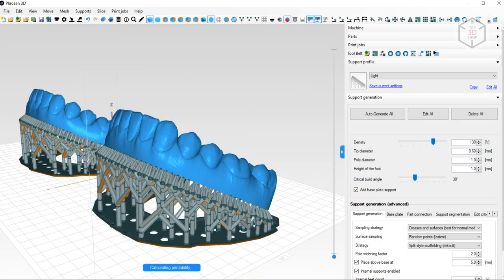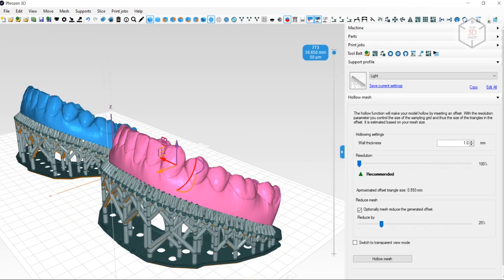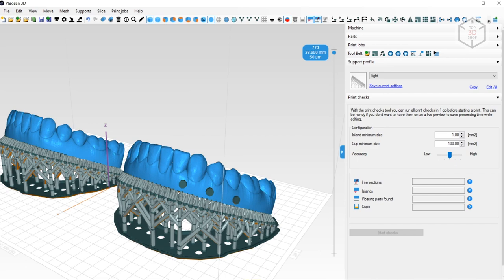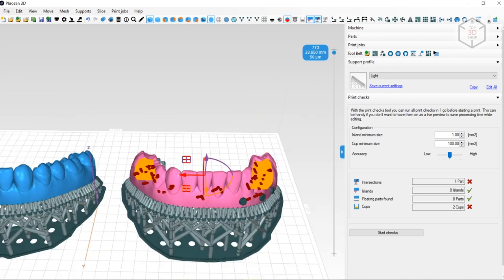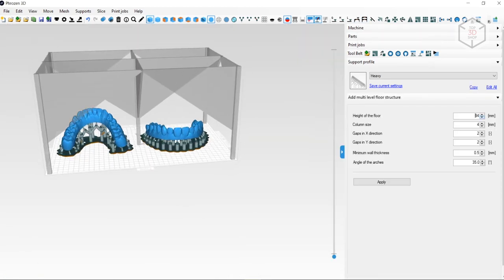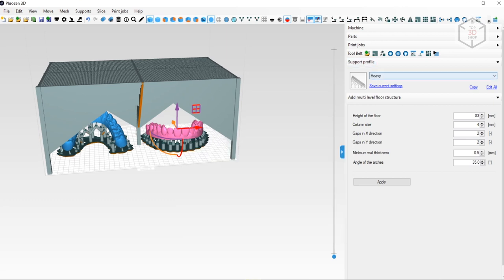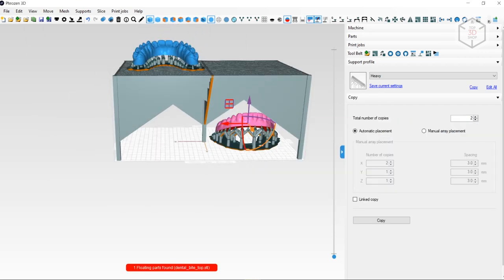There are a lot of settings for supports, and the user can change any part of them. Make models hollow, add drainage holes, create special infills inside hollow models suitable for printing with resins. There's also a built-in function to check the prepared models for the presence of unselected areas needing supports, errors in the models, and other imperfections that can negatively affect the print. There's even a feature that allows you to stack the objects on top of each other and print 2 or 3 times more models utilizing the entirety of the printer's build volume.